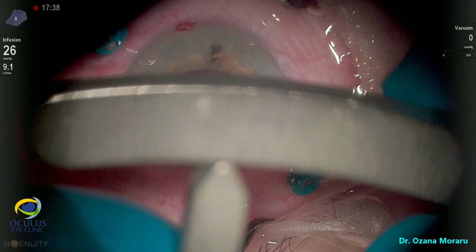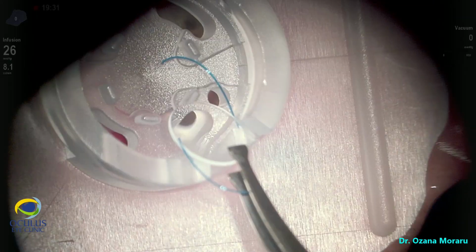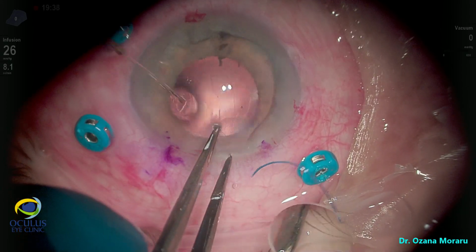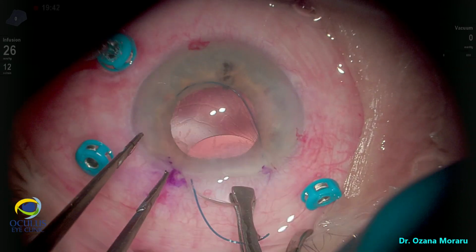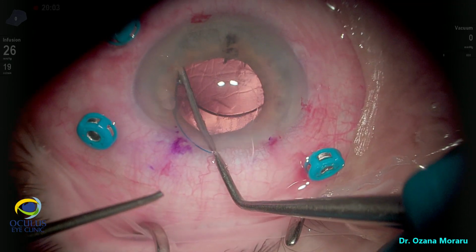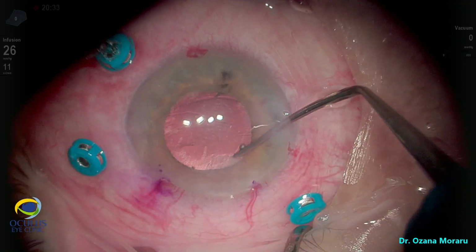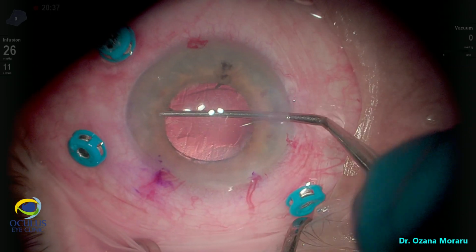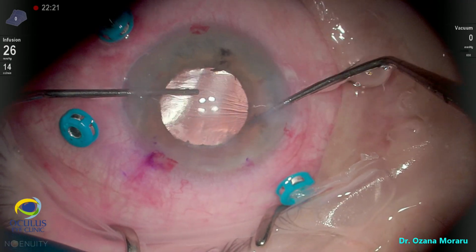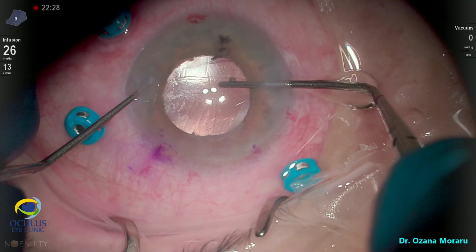In order to make the implantation of the 3-piece IOL safer, we prefer to enlarge the limbal incision to 6 millimeters and to implant the IOL unfolded, because it is more controllable and much safer to implant it unfolded than folded. If you implant the IOL folded, either with forceps or with a cartridge, the forces of unfolding can be so strong that you cannot control well the positioning of the IOL on the anterior capsule. So this is what we did.